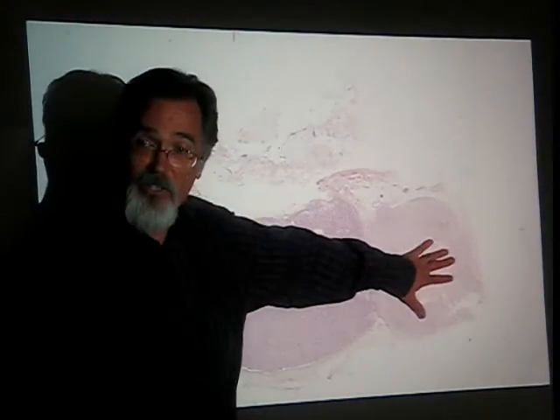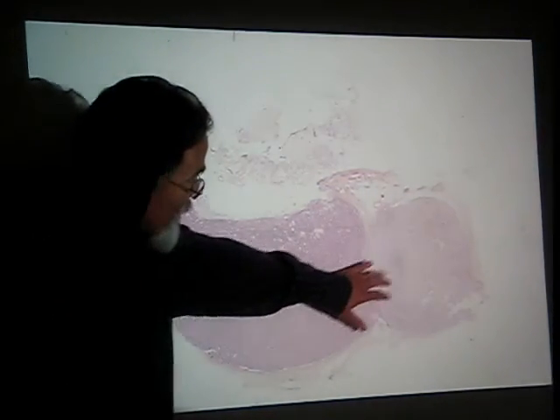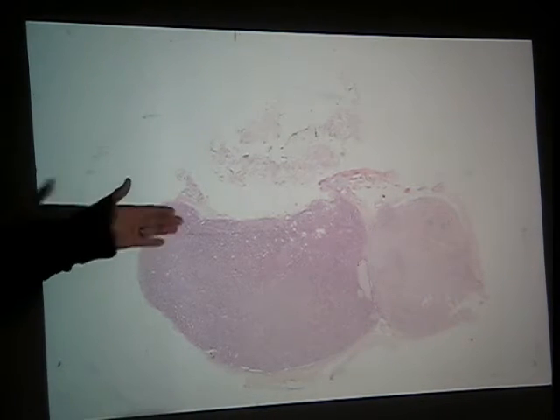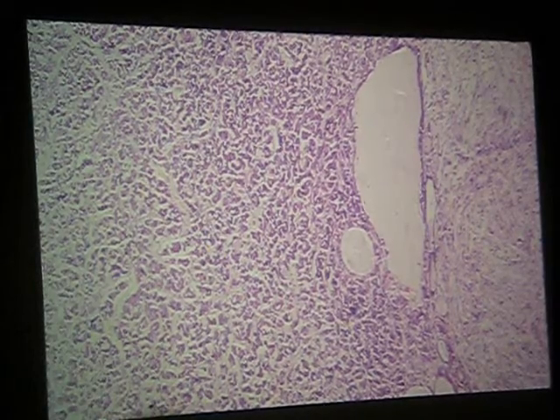Adenohypophysis. Posterior or? Good. And you can see these colloid-filled cysts of the pars intermedia. So pars distalis, pars intermedia, pars nervosa. The tuberalis would wrap around the infundibulum and the infundibular stalk. It's above or below the plane of section. High power. Again, eosinophils, basophils, I'm not going to ask you to identify them, but you need to know what hormones they produce and what the hormones do. And I'll elaborate on that in a minute.